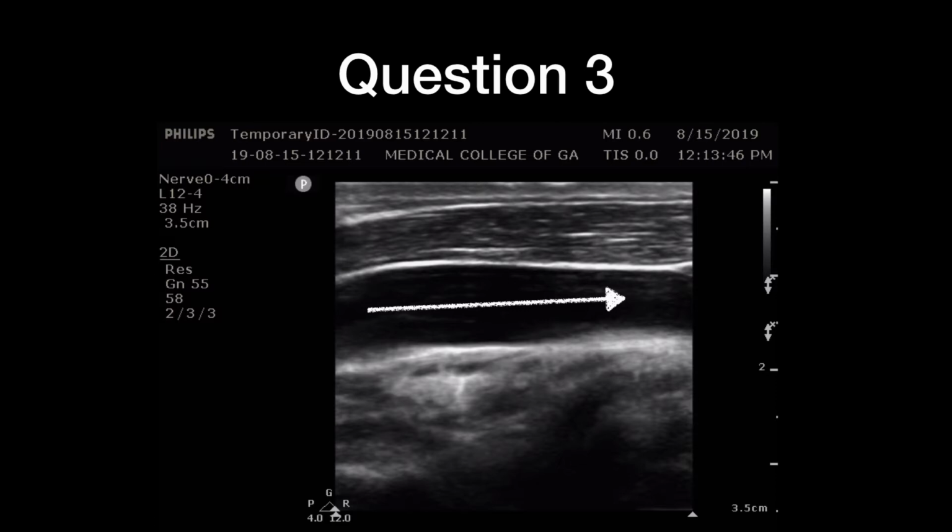The main reason that we emphasize that you should label your images before you leave the lab is so that you can remember when you're looking at them which one was the artery and which one was the vein, as they can be difficult to tell apart.